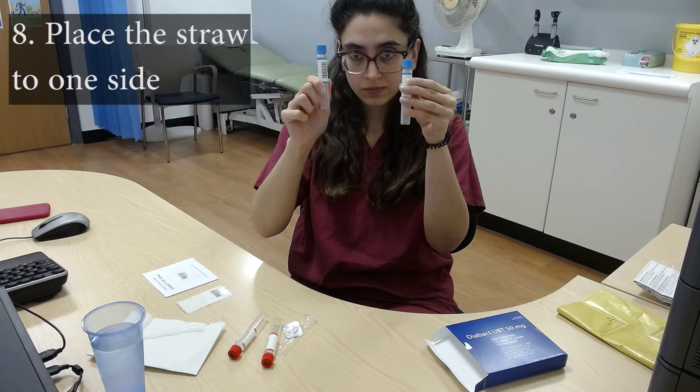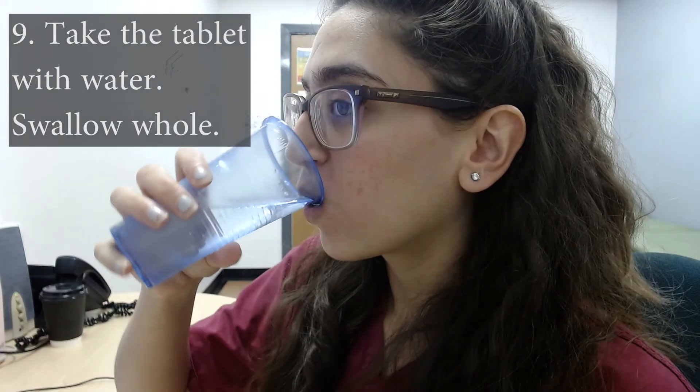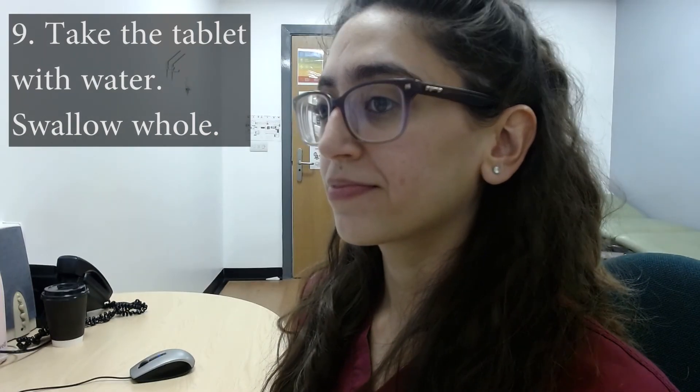Place the straw to one side. You may wrap it in a tissue or back in the box for a moment, as you will need it again after the next steps. Remove the tablet from the packaging and take it with a glass of water. It must be swallowed whole — please do not chew the tablet.